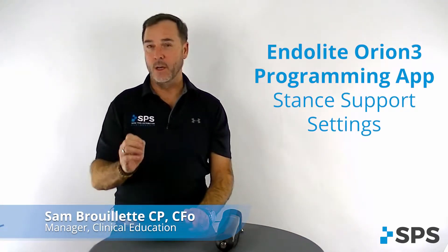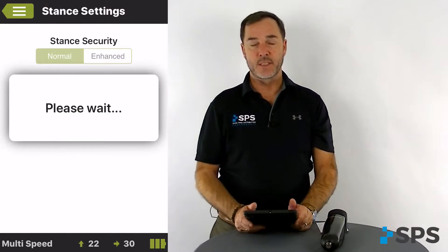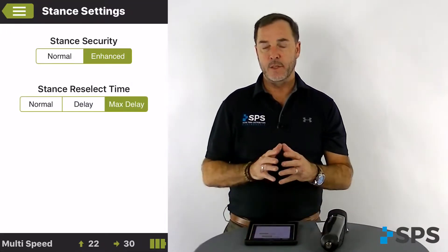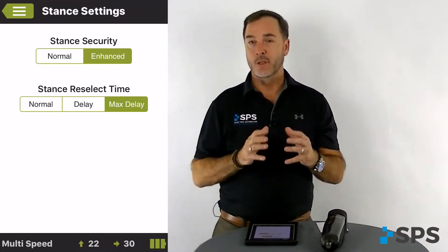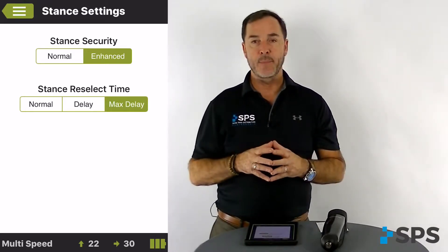Okay, under your fine-tuned tab, we're going to look at stance support settings. This would be the same screen whether you're in clinician version or super user. Stance security at the top is the transition point at which the knee will go into swing phase from stance — normal settings apply during normal circumstances.